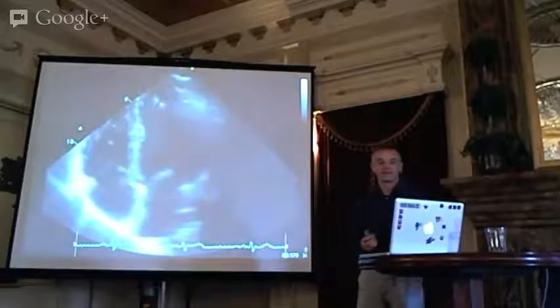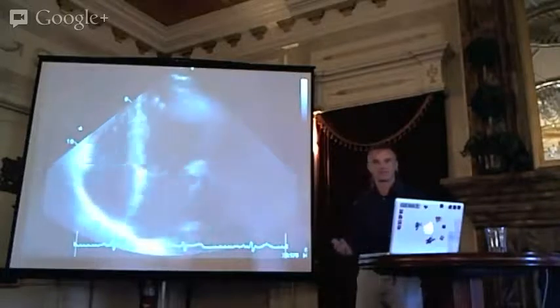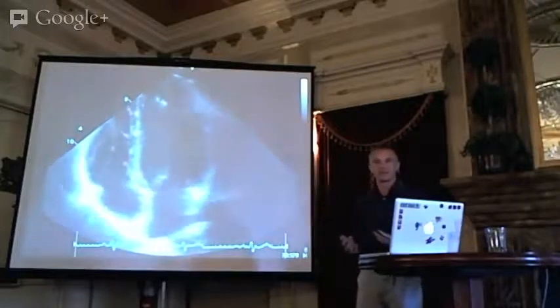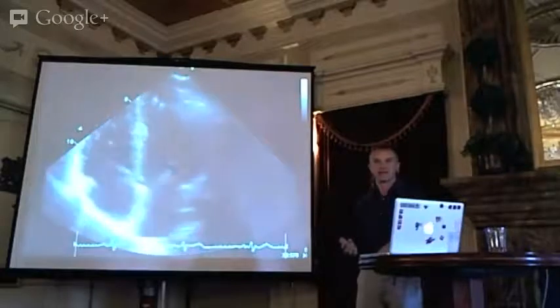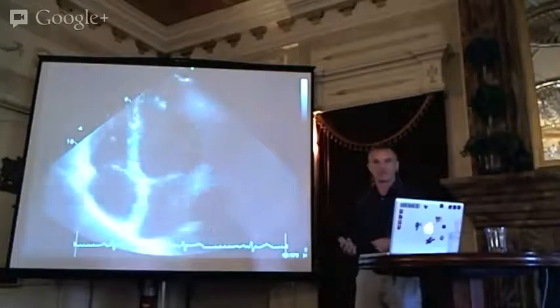Well, I would say that from an emergency medicine point of view, a bedside decision making in a resus room point of view, I don't think you need all four views. We've seen that you can spot them on one view. I think you need some options though. And I think it's good to be able to go transabdominally or transthoracically. So I might combine the parasternal long axis view, which is my favorite, with the subcostal four chamber view.